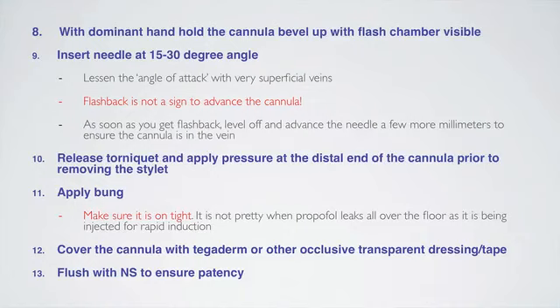So cover the cannula with a Tegaderm or other occlusive transparent dressings or tape, and once that is all finished, flush the cannula with normal saline to ensure patency.